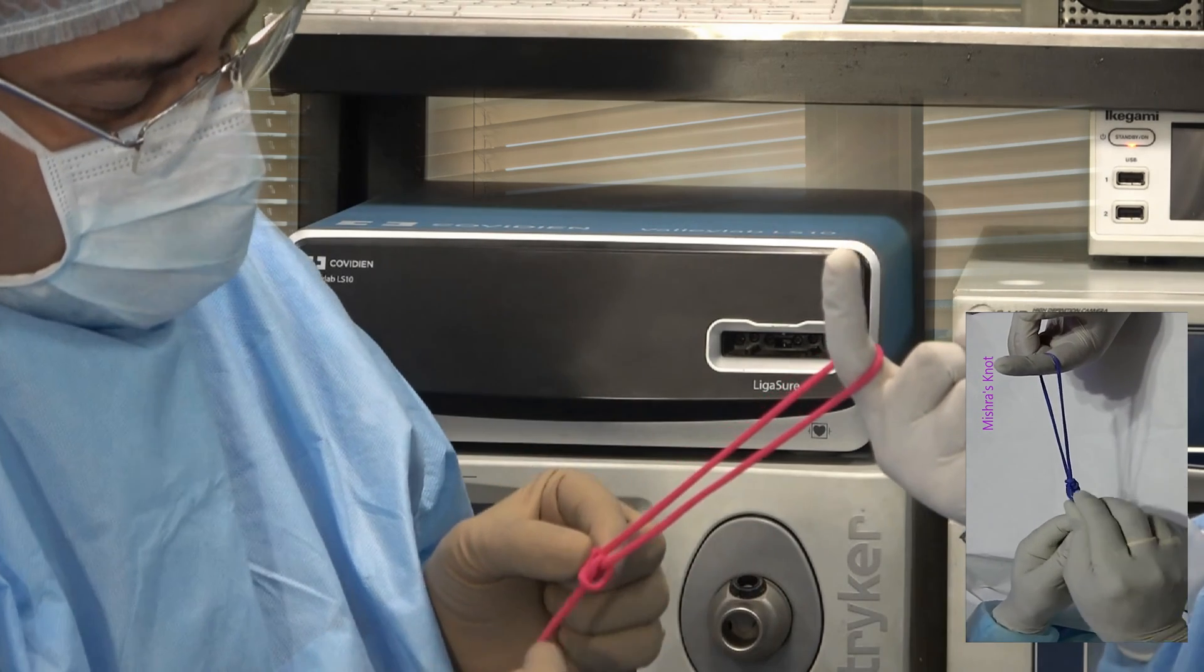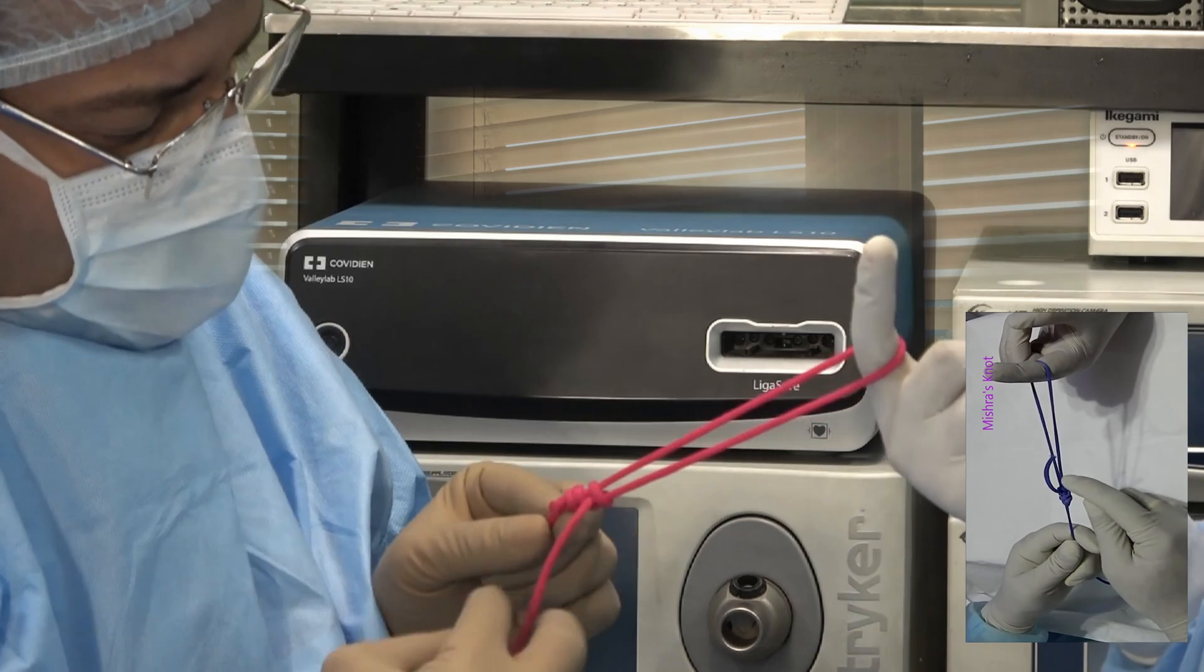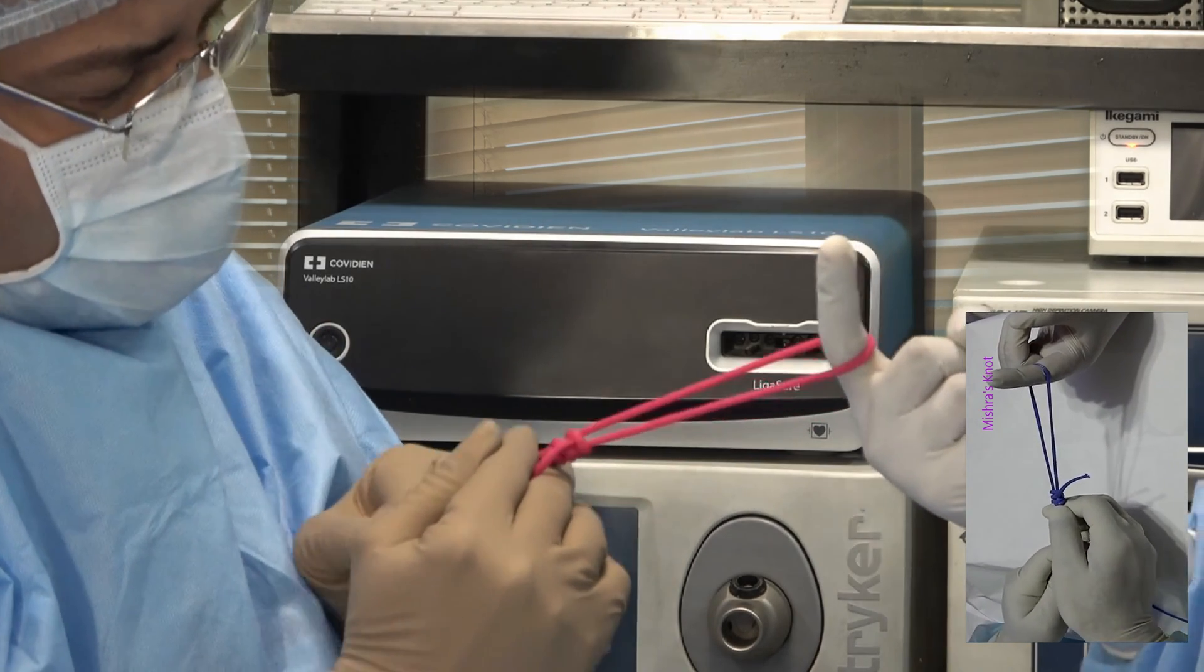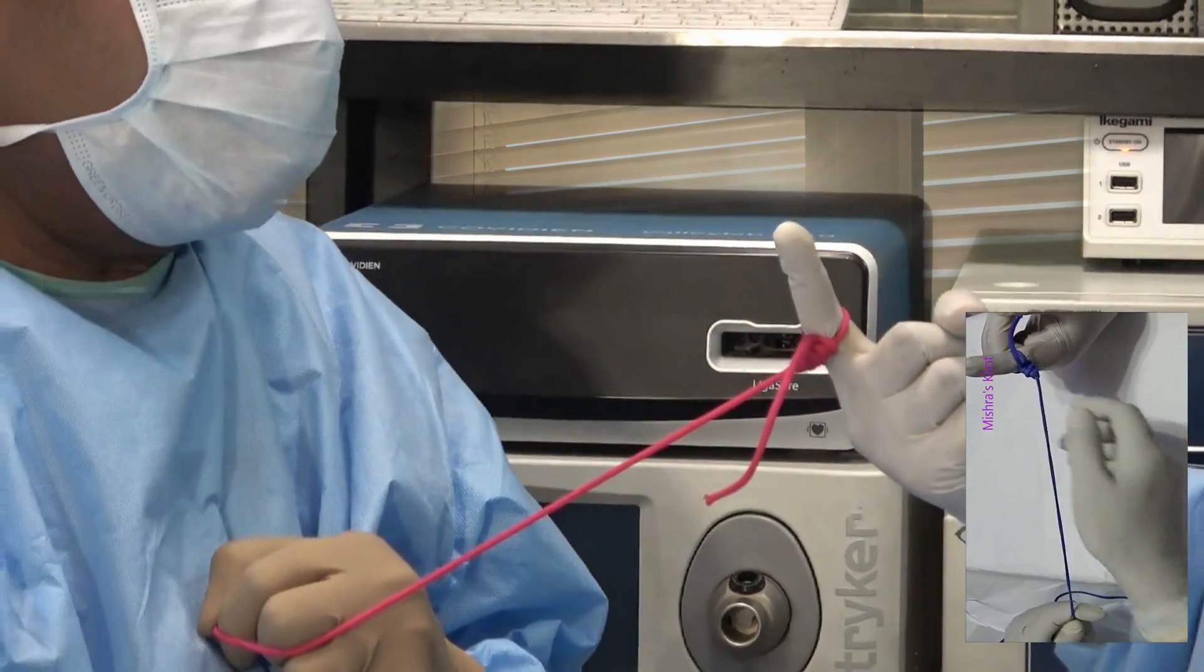So the configuration is one, one, one, one, one. After every wind, there is one lock. And this is a very secure knot and can be slid with the help of a knot pusher.